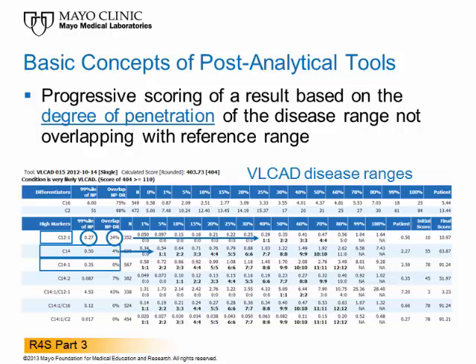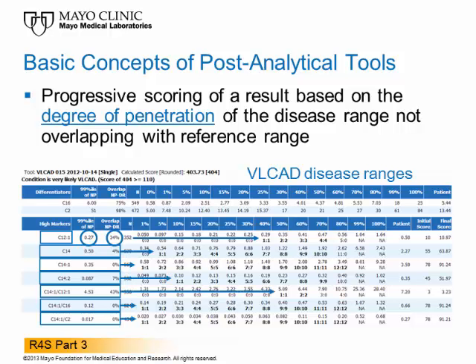C14-1, with no overlap, generates a score immediately after exceeding the 1st percentile of a disease range and continues to do so all the way up to the 80th percentile. This action is repeated for all remaining analytes and ratios simultaneously, and that is why this process is called a parallel algorithm, where there are no dependencies between one analyte and another, the and/or rules.